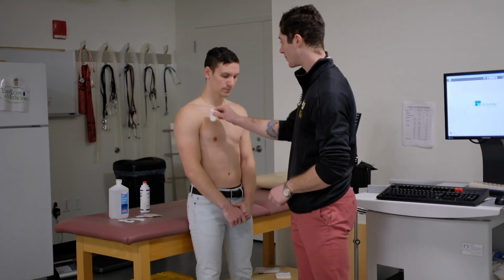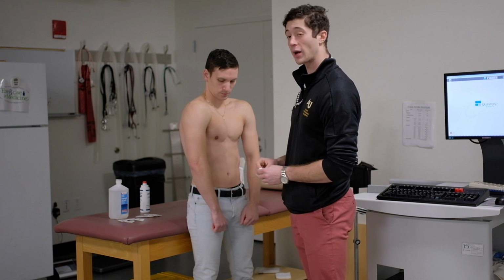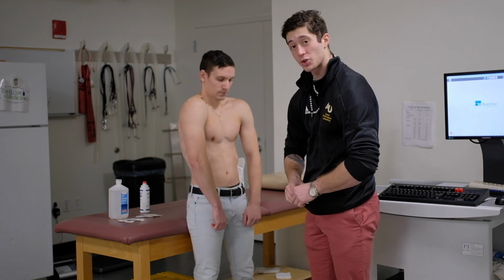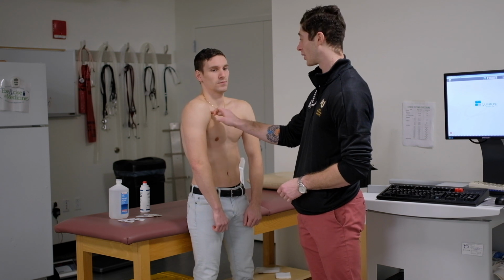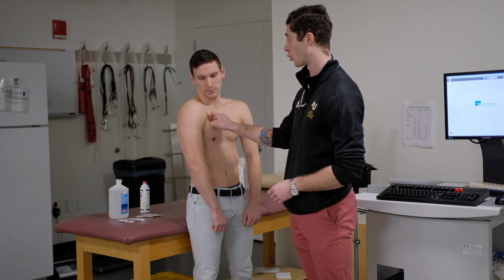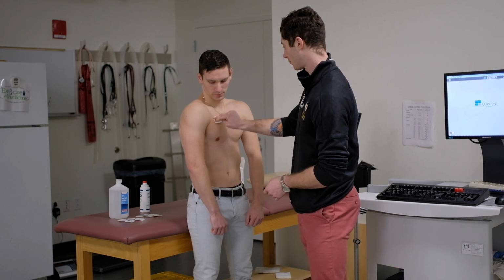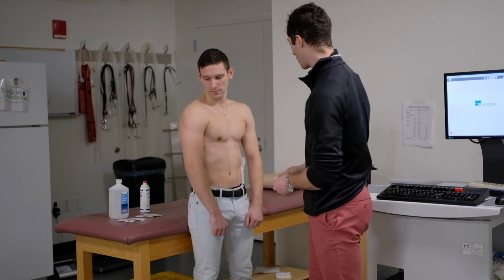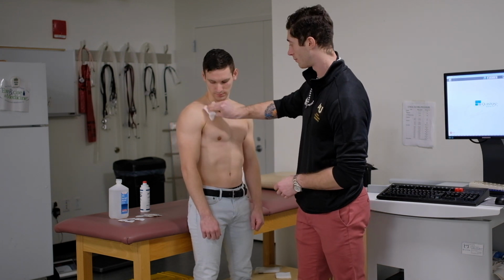The first site that we can wipe down is the right arm. We're going to ask the subject to roll their shoulders forward. We're going to look for the indent between the shoulder and the collarbone in the furthermost corner of the right arm. That would be right here. Wipe that down nice and thoroughly. We'll take another piece of gauze to go ahead and dry that area off.